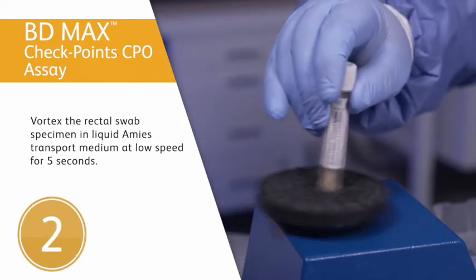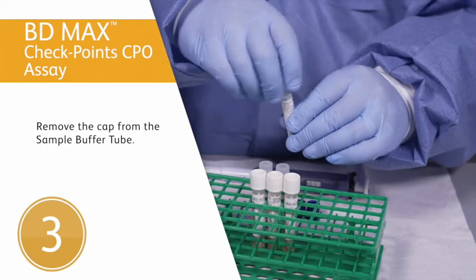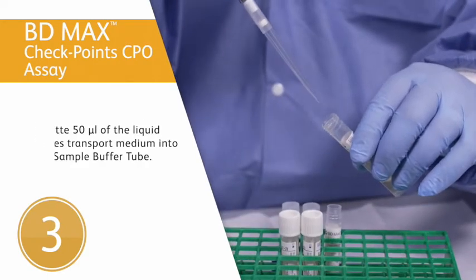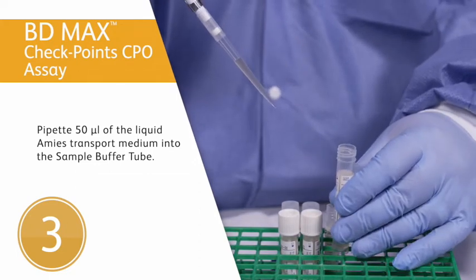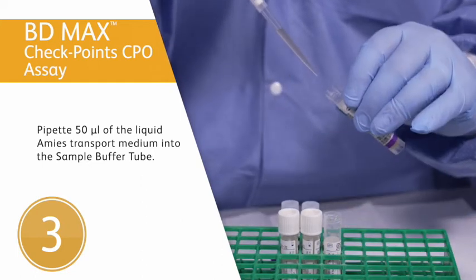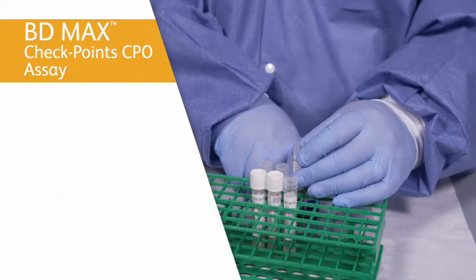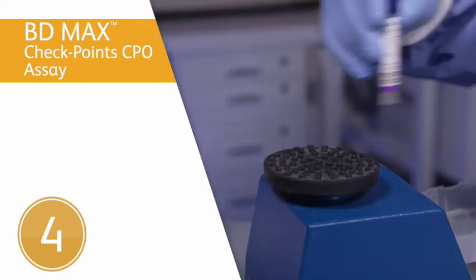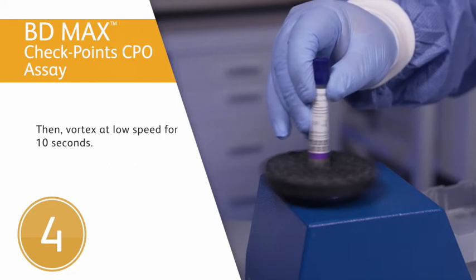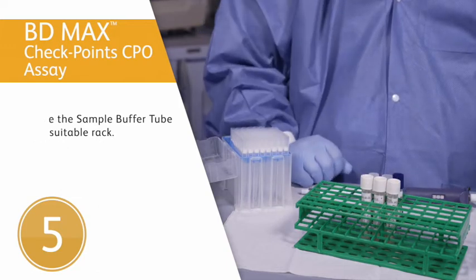Second step: vortex the rectal swab specimen in liquid transport medium at low speed for 5 seconds. Third step: remove the cap from the sample buffer tube and pipette 50 microliters of the liquid transport medium into the sample buffer tube. Fourth step: recap the inoculated sample buffer tube using a septum cap and vortex at low speed for 10 seconds. Fifth step: place the sample buffer tube in a suitable rack.